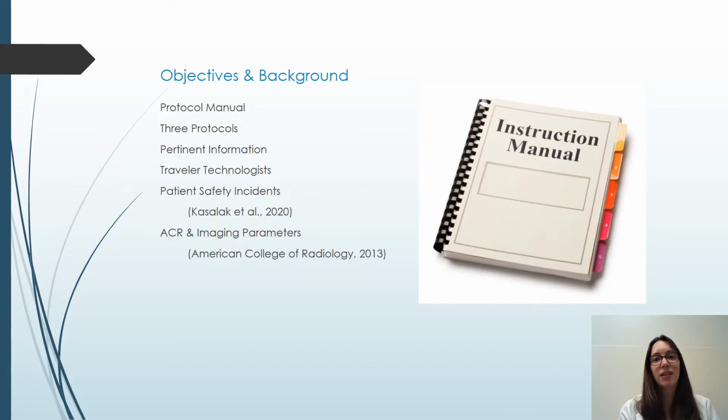The Polyclinic is accredited by the American College of Radiology, also known as the ACR, and when applying for accreditation renewal, the ACR requires that information such as the radiopharmaceutical, dose amount, collimator, imaging time, matrix, and other imaging parameters be submitted using the clinical test image data sheet. These imaging parameters are defined in the protocol manual so that the Polyclinic is now compliant with ACR requirements.